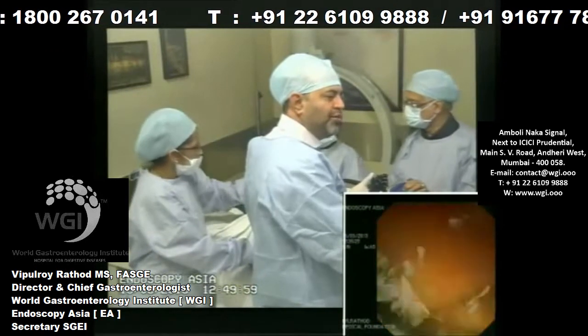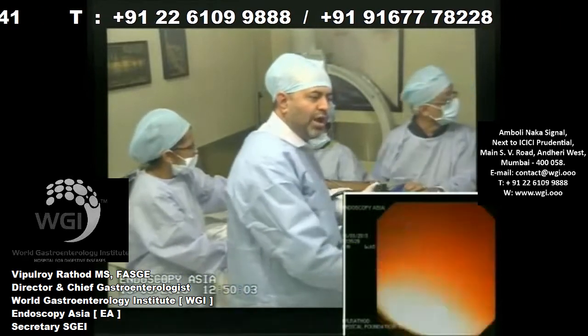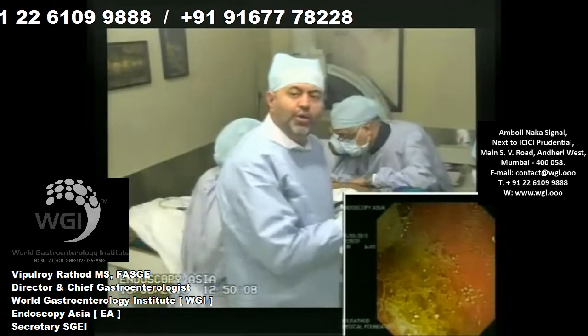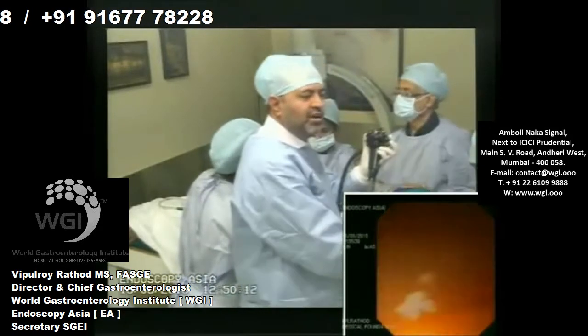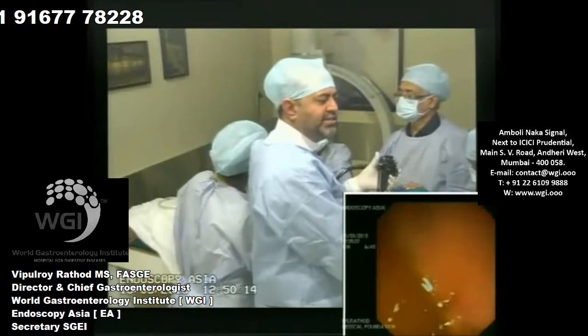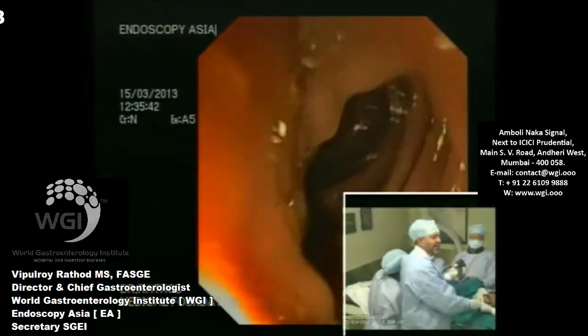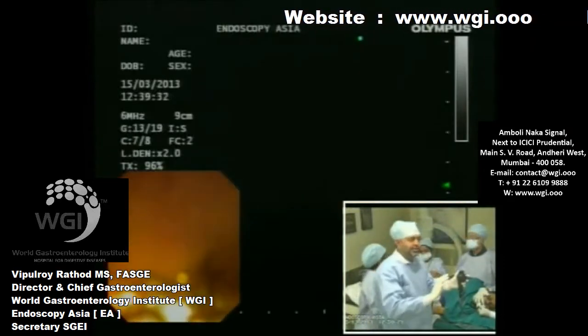So what we're going to do now is evaluate what's happening in the pancreas. I want to highlight certain salient features of the role of EUS in the pancreas, especially in indeterminate obstructive jaundice, where we don't know what's happening. I can see some bile there, and let us see what we find in his pancreas. So we will now switch over to ultrasound. We always go to the second part of the duodenum. Park your scope there and go to ultrasound.